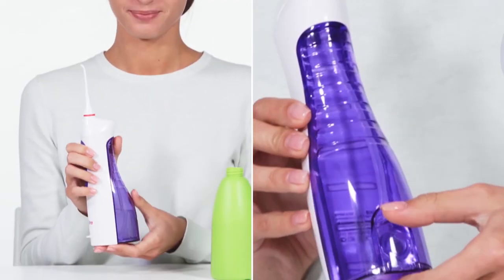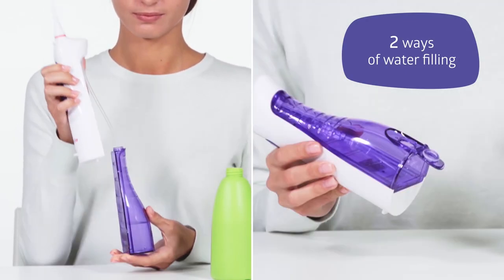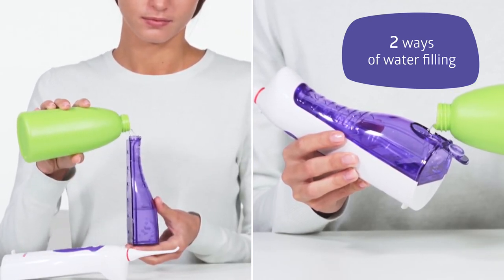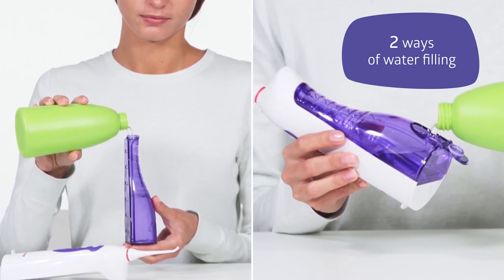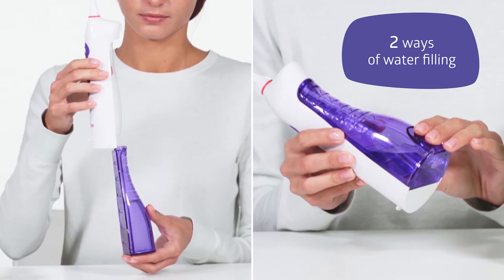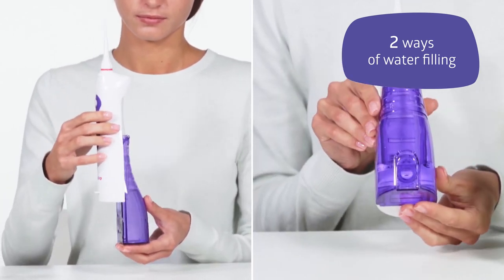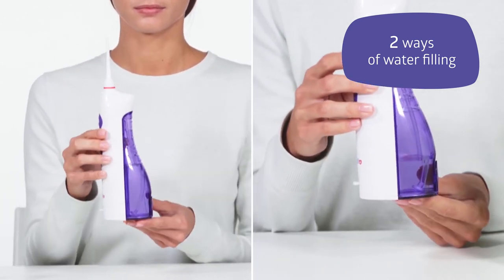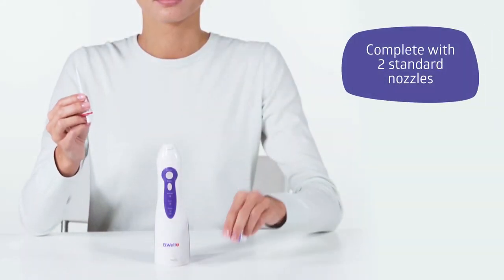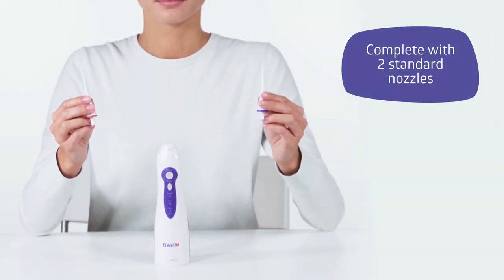Pour some warm water into the tank. The Be Well Irrigator offers two water-filling modes. You can use regular tap water. However, your device will serve longer if you use filtered or bottled water. As an option, you can add a special solution for irrigators.